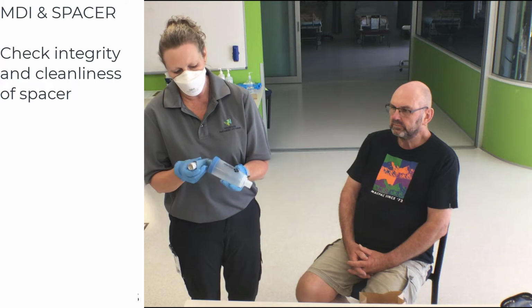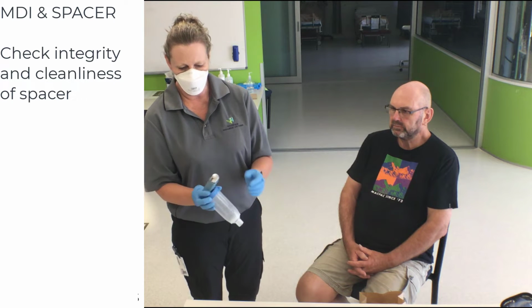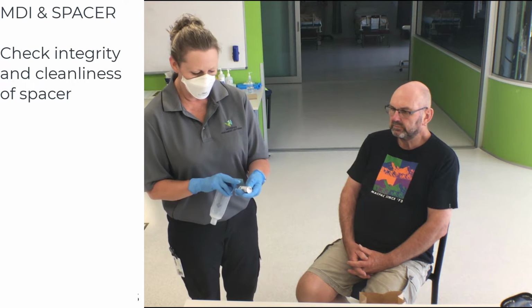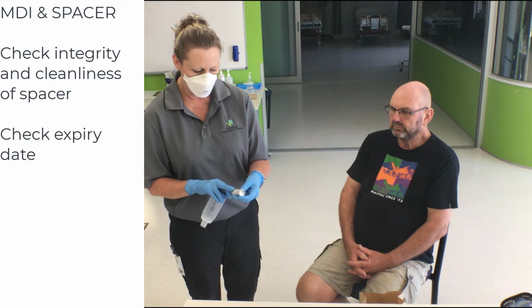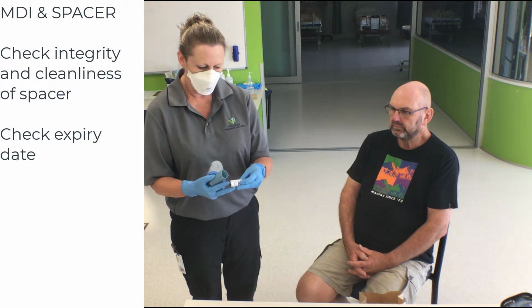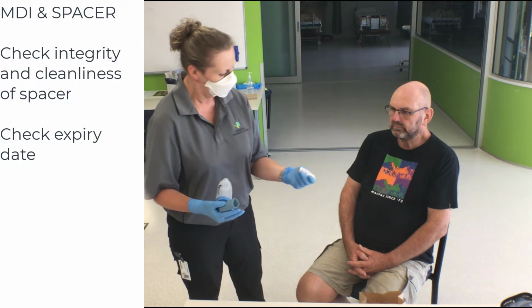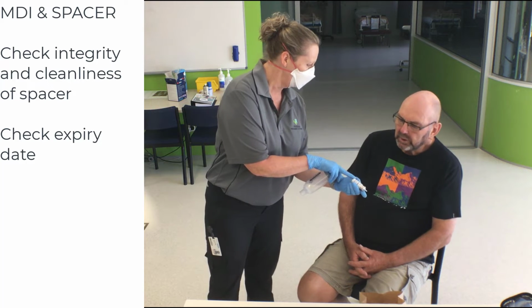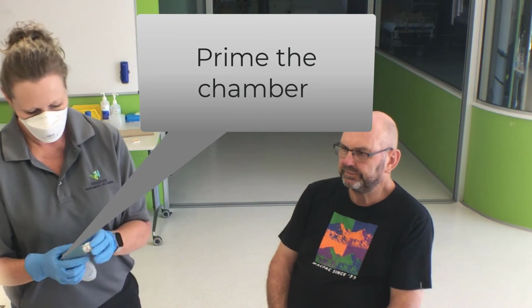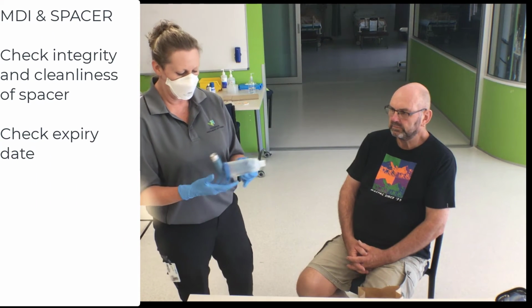So we need to place the MDI into the end of the spacer, and the other thing we'll be doing is checking the expiry date of the medication. And so the expiry date here is 2028. We can just check that with the patient. You're happy that it expires 2028? Yeah. Okay, so then we're just going to coach the patient through this.